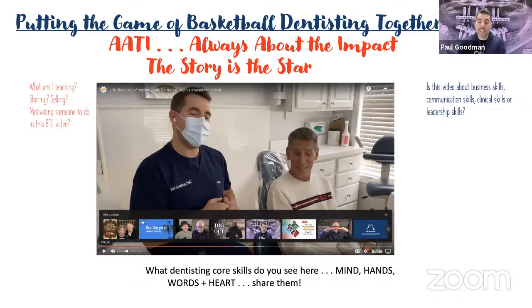So one of the things I've learned is that with these cases, once patients get a fixed implant prosthesis or removable implant prosthesis, and something happens, acrylic breaks, they drop their denture, one of the attachments needs to be replaced at the lab instead of chairside, they are very frustrated to have to give it up and send it to the lab. So what I do now is I use the short-term denture, golden nacho tip.